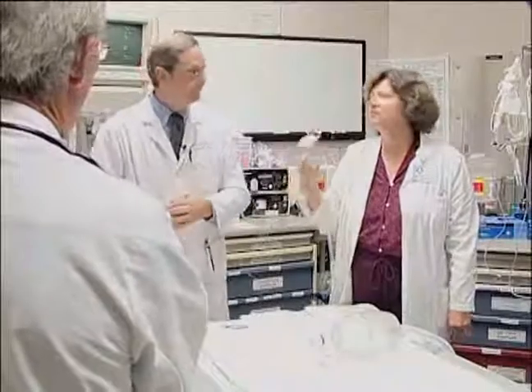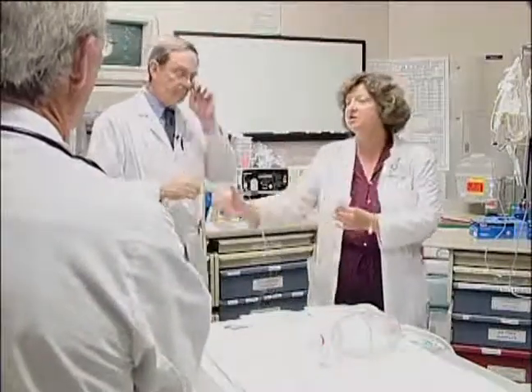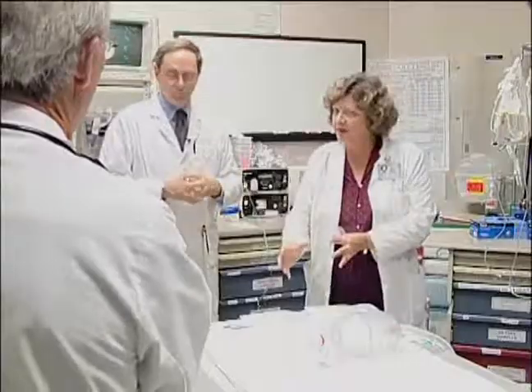But our personal preference, mine, is this. I like for you to have this in your hand when they break the connection and you move the patient over, because we want the patient to be ventilated on a regular ventilator with a tidal volume we know about and can set right away.